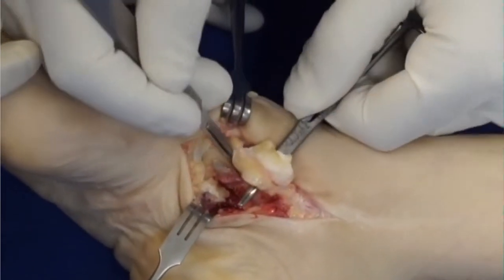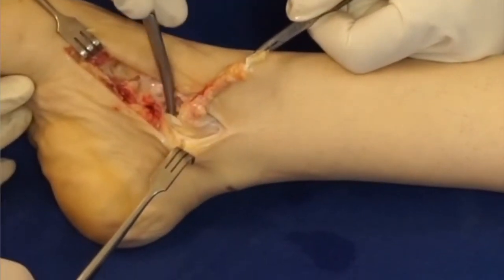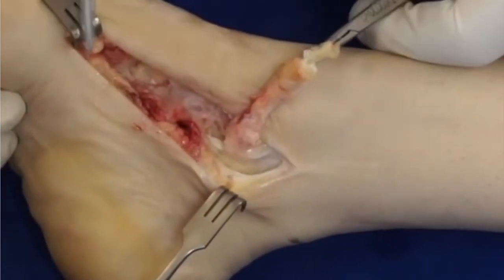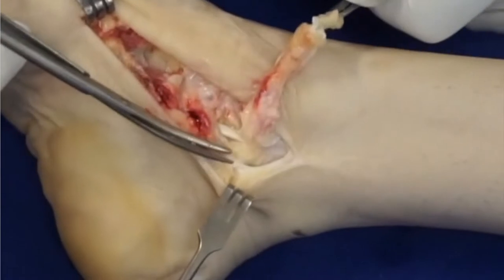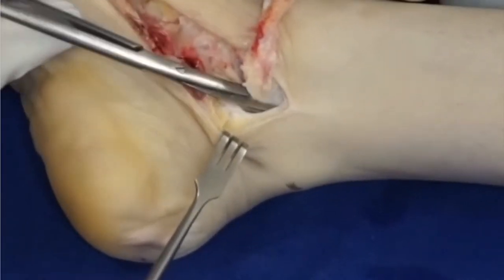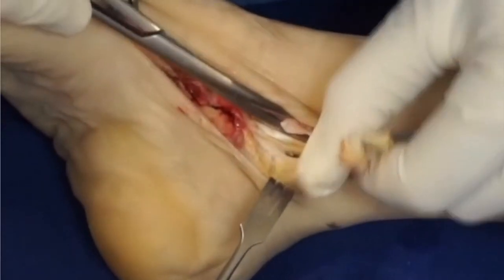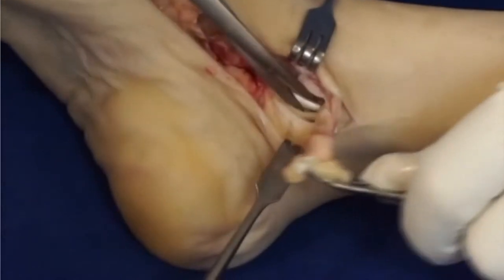Once you've got your tendon separated, you need to begin to isolate it at the medial malleolus. You'll see the flexor digitorum longus there. By lifting up the posterior tibial tendon, you recognize that you've got to release the flexor retinaculum. I begin by doing that directly on top of the FDL tendon, releasing the retinaculum. If you don't do so, that tendon will not easily pass behind the malleolus. So I'm going to release the tendon and gradually dissect it off until it is quite free and mobile.